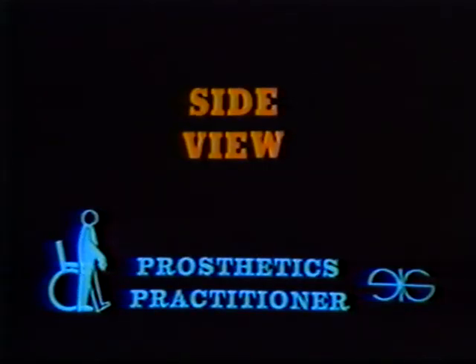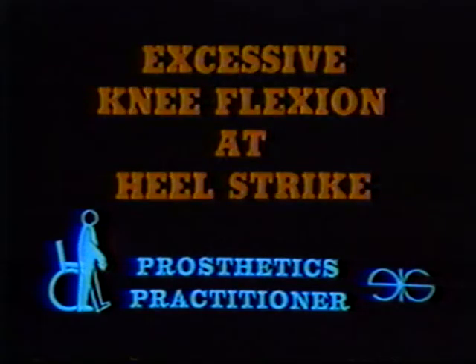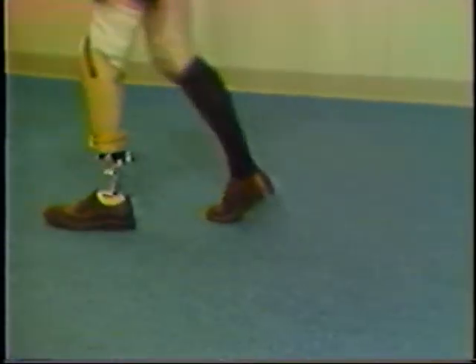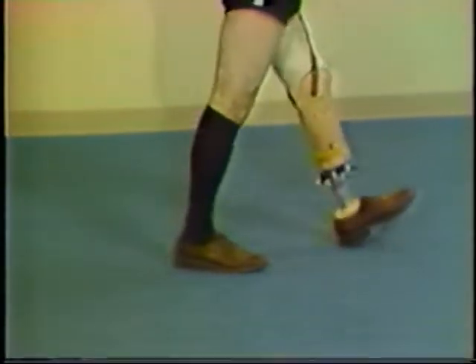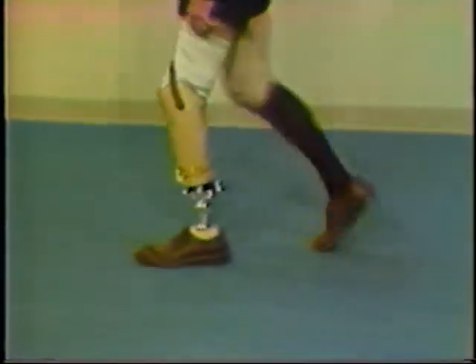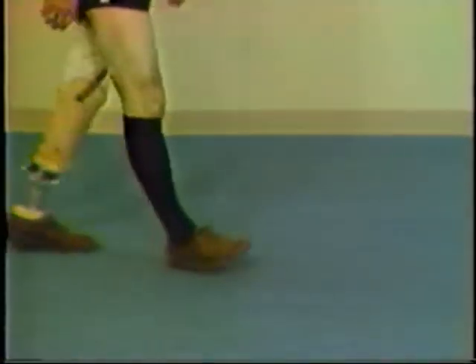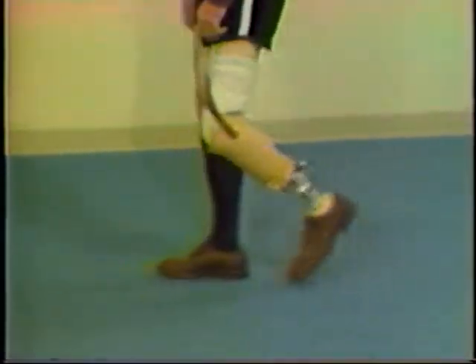The following gait deviation is the first of three you should observe from the side as the amputee walks. First, we look at excessive knee flexion at heel strike. Notice how the knee buckles and will not carry the amputee's weight. The knee kicks forward when this deviation is present. The amputee may say that the anterior distal tibia hurts. Observe the knee buckling as the amputee enters stance phase. This can be caused by too stiff a heel wedge, the foot position too far posterior or too dorsiflexed, or the foot too tight in the shoe hampering foot action.